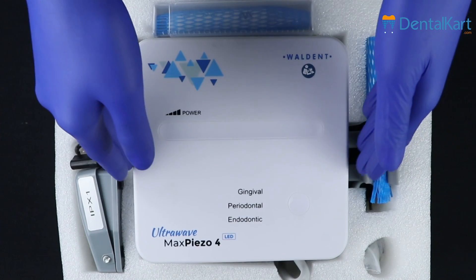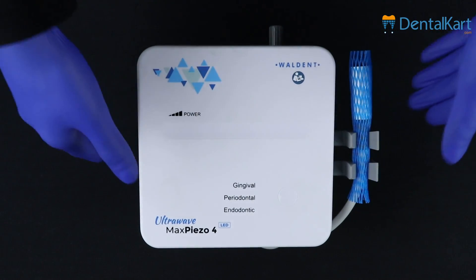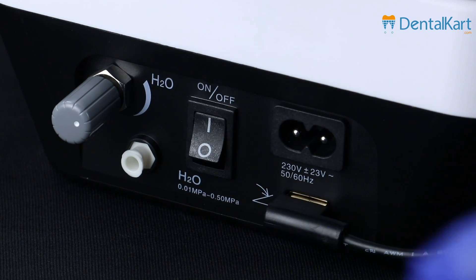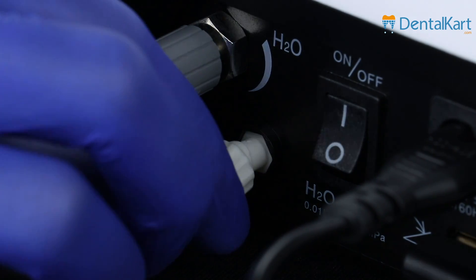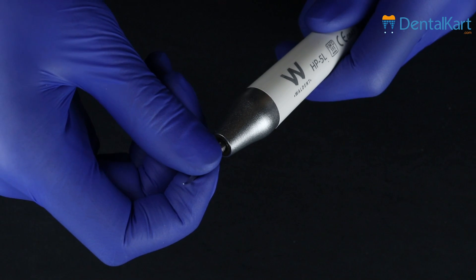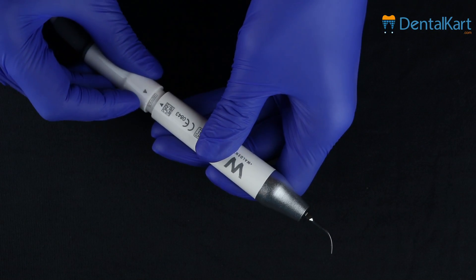Open the package, take out the device from the box and place it on a stable surface facing the operator. Insert the plug of the wired foot switch into the reciprocating socket. Connect the connector of the liquid pipeline to the device and input pure water to it. Fasten the tip to the handpiece with the torque wrench, and then correctly connect the handpiece with the handpiece cord socket.